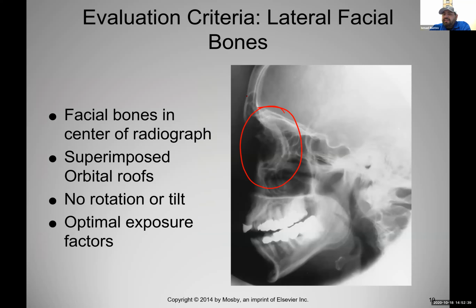Primarily what they're going to use this for is any type of anterior posterior fracture, separation fracture. So if maybe this part of the orbit comes forward, right, or this part goes backwards, they'll be able to see that. Okay. If maybe, you know, but down on the infraorbital margin, right, one goes forward, one goes backwards, they'll be able to see that on this lateral position, projection.